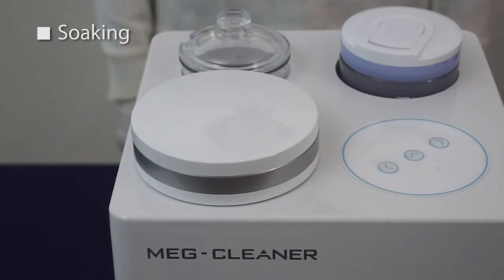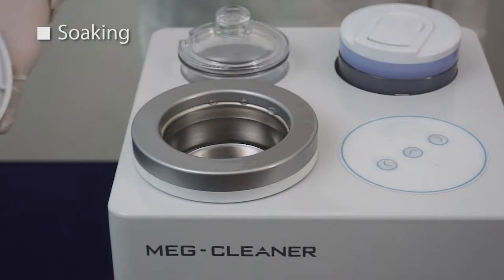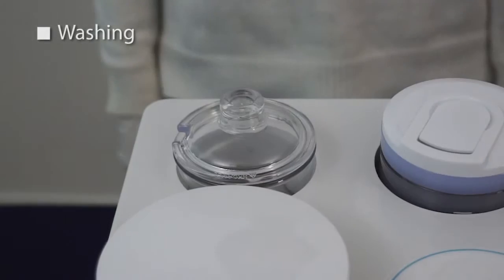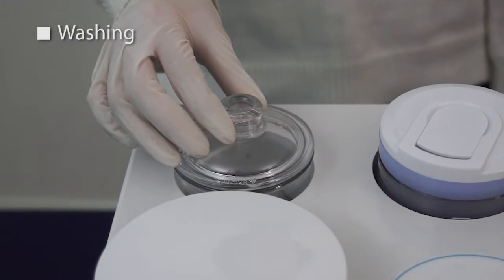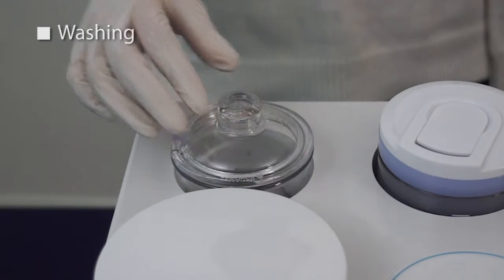Using the soaking jar function more effectively removes contaminants by using the 40 kilohertz high-performing ultrasonic transducer. Using the washing jar function can have a powerful cleansing and polishing effect on the object by making the high-speed pins rotate.